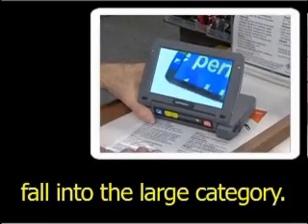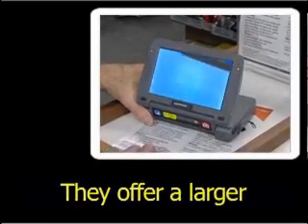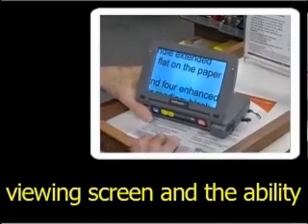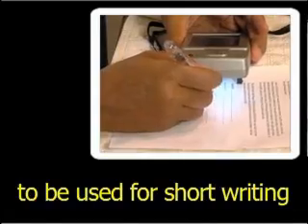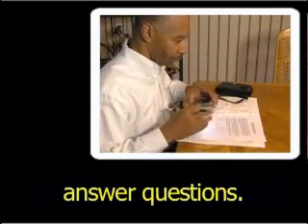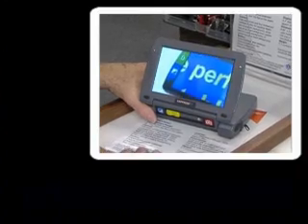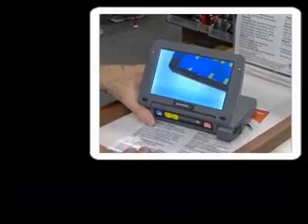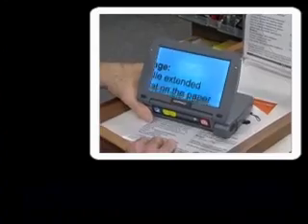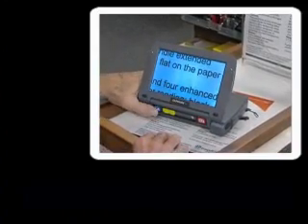The units shown here fall into the large category. They offer a larger viewing screen and the ability to be used for short writing tasks, such as writing a check or completing short answer questions. One unit scans a sheet while its enlarged image is displayed on a screen that angles up from the scanner portion.